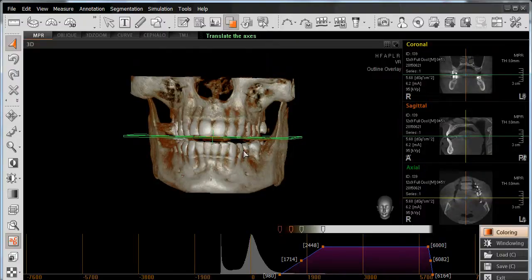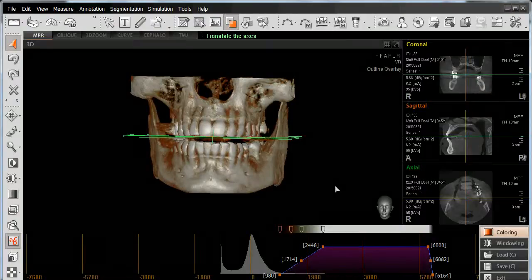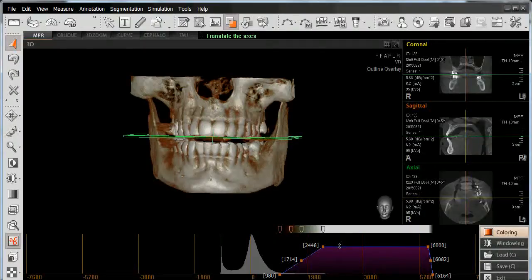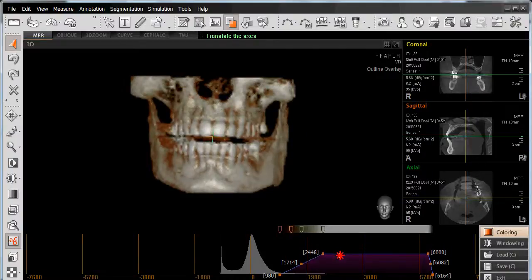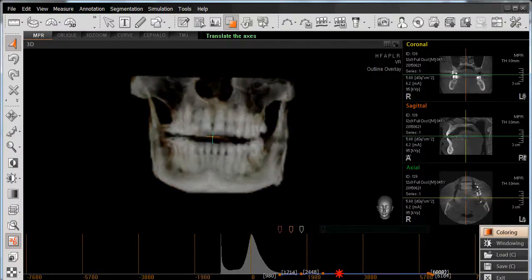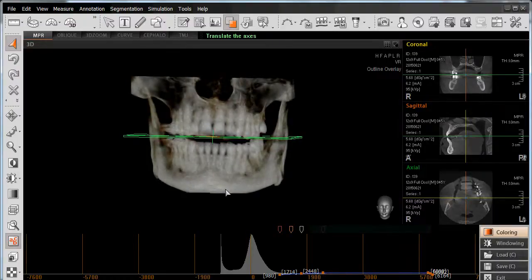The last function is the ability to adjust our transparency — being able to see past the cortical plate to see the outline of our roots. To do that, position the mouse where it's shaped like a triangle, move it down on top of the horizontal line where it changes into an up-and-down arrow. Left-click, slide it down towards the base, and let go of the mouse, which generates a transparent view of our anatomy. However, it may appear somewhat washed out, so this is where we can fine-tune our view.